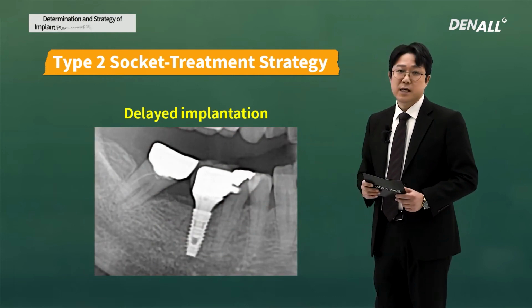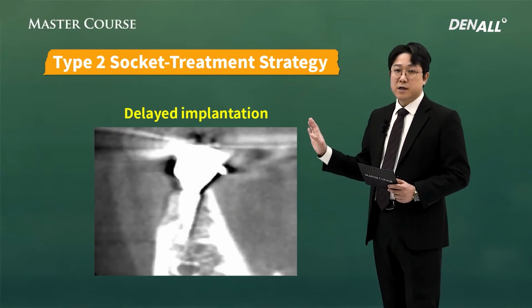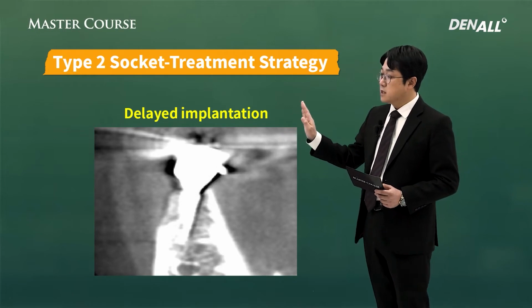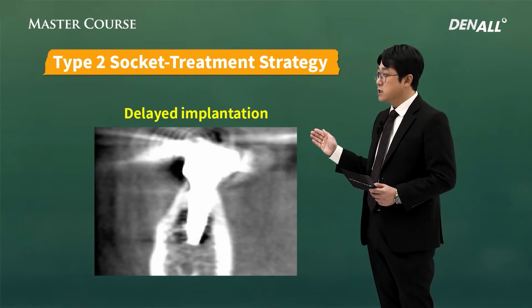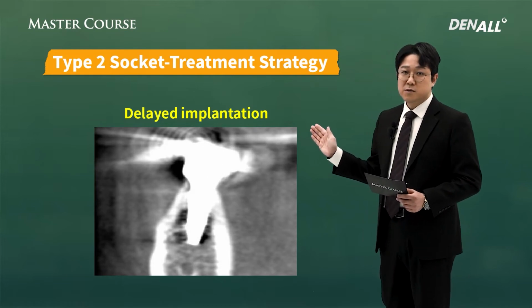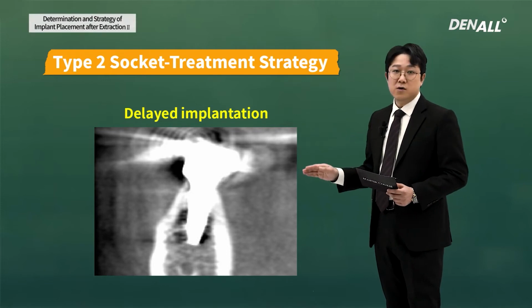This is after treatment at the end of July. If you look at CT, buccally, the bone graft is not fully maturated, and you can still see bone graft, but after 1 year at follow-up, the bone graft on the buccal side, you can see that it has regenerated into a normal bone.